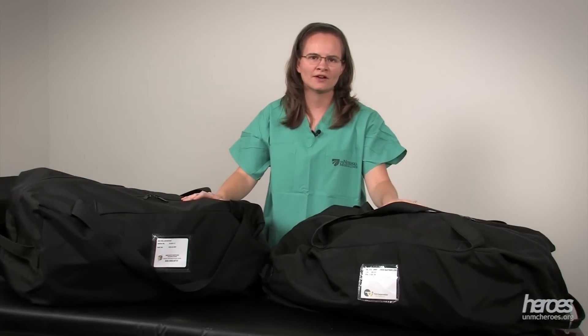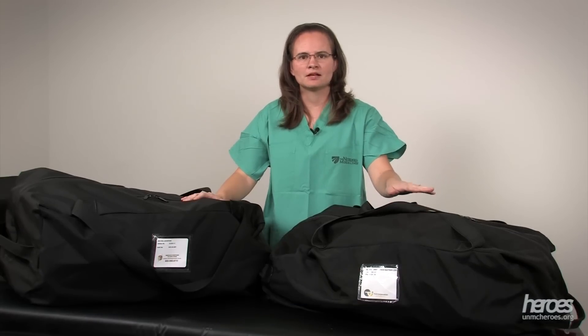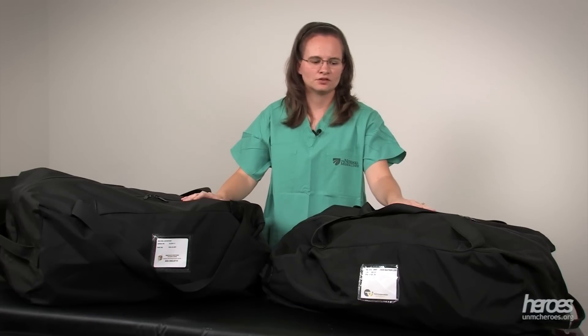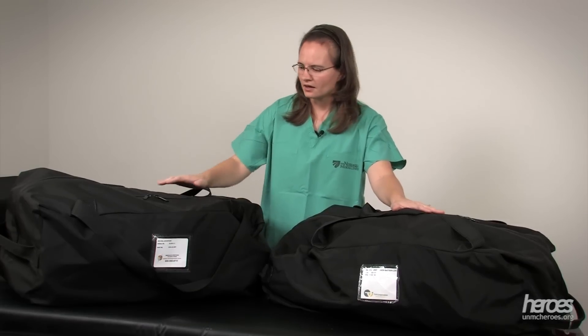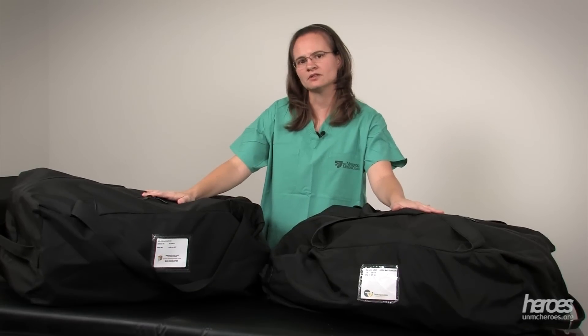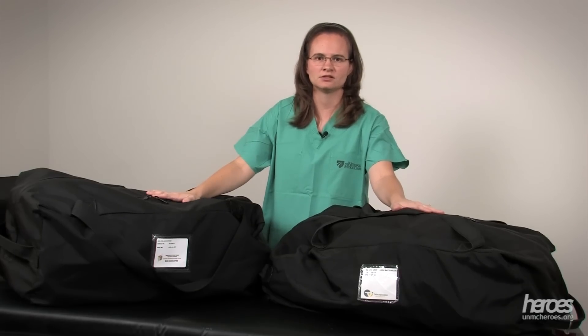The isopod is a portable vinyl enclosure that creates a negative airspace to transport patients with biologically infectious diseases. The isopod has been made by different manufacturers over the years. You may find some made by a company called TVI and others by a company called Immediate Response Technologies. This video will cover the assembly of the isopod from the Immediate Response Technologies Company.